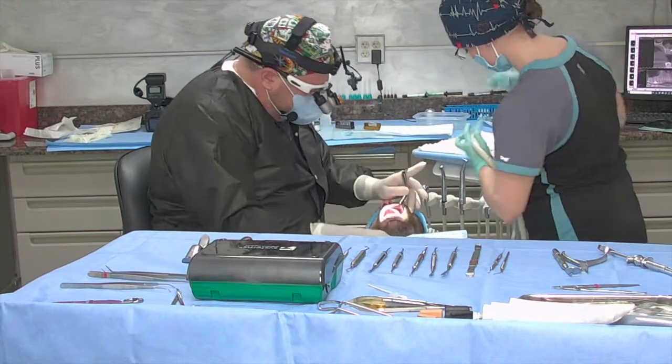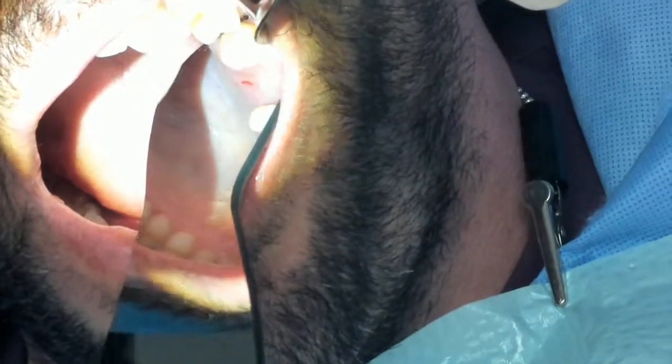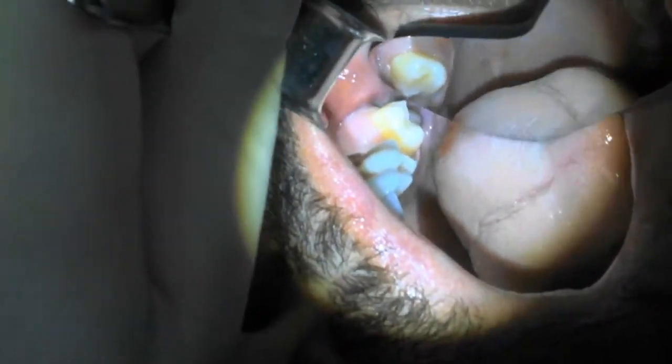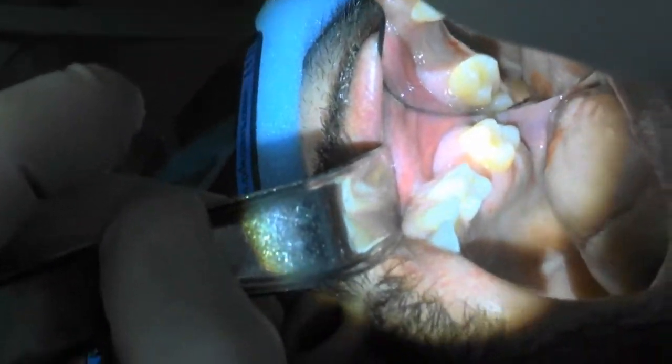So let's take a look here in the mirror if we can see occlusally. You can see the little concavity. Is that good, guys? You can see the concavity in the facial plate, easy to take care of. But as I start to rotate a little bit more with the mirror, you see some of the height that we've lost at the buccal crest.